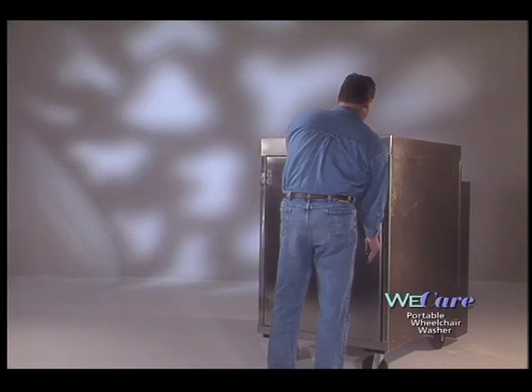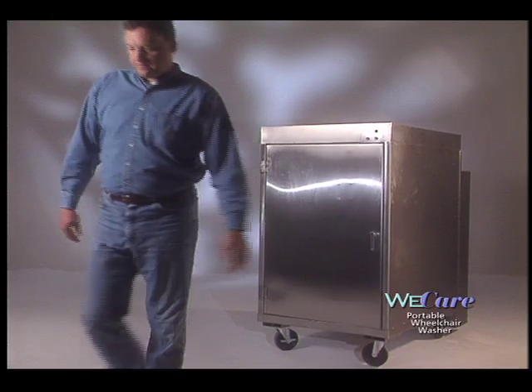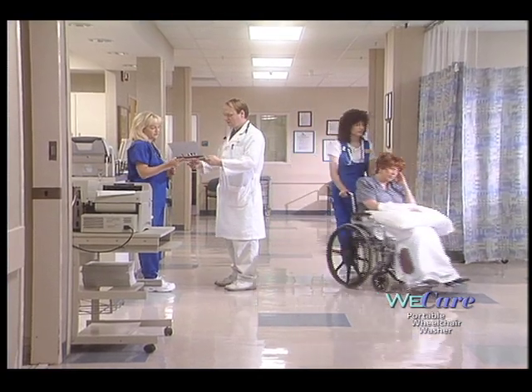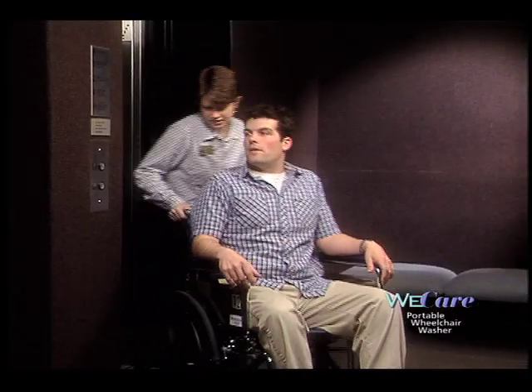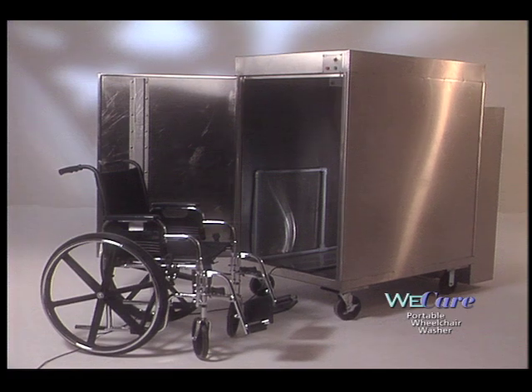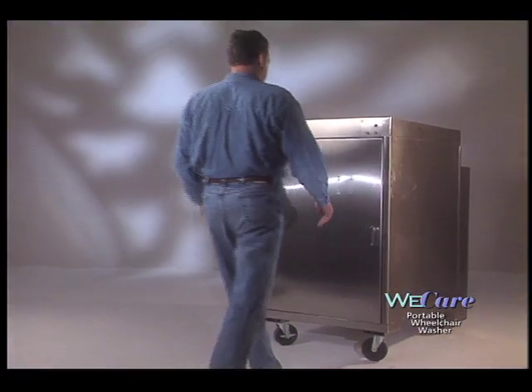Taking your car to the car wash makes it easy. And now that same service is available for wheelchairs with the WeCare Portable Wheelchair Washer. Long-term care providers need to wash their wheelchairs twice a month at the minimum. The best way to efficiently meet this standard is to automate the wheelchair washing process.